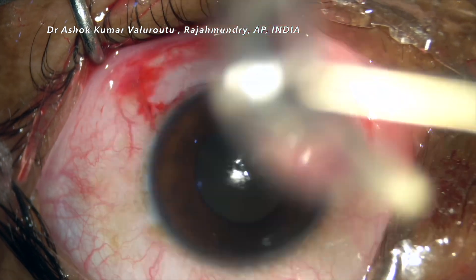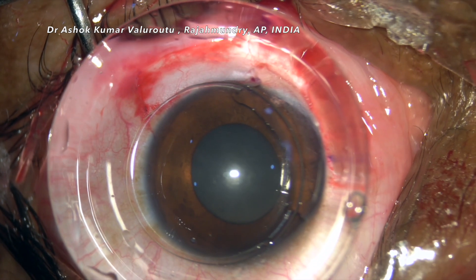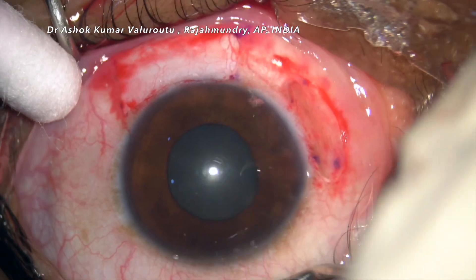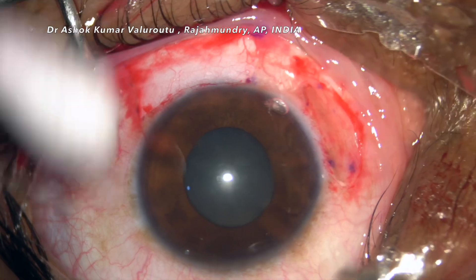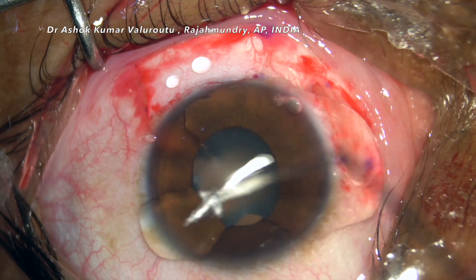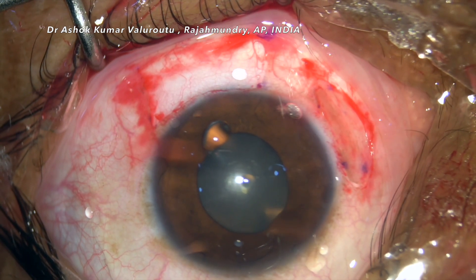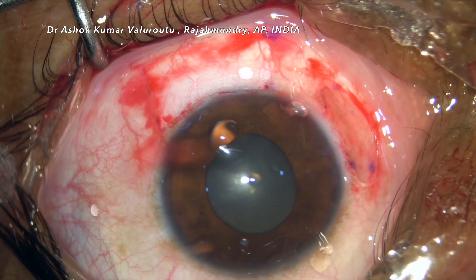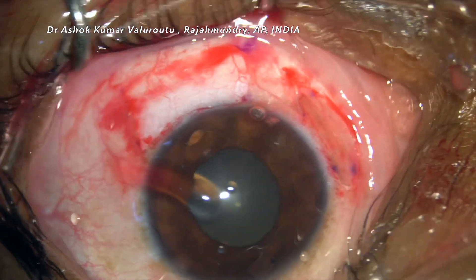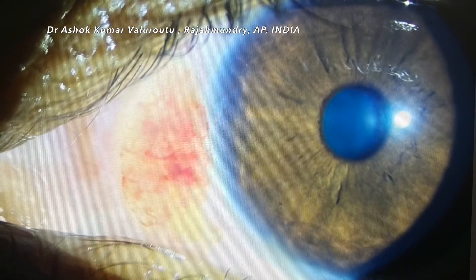The next step is placement of a sclerocorneal contact lens. The lens I am using is marketed under the brand name Terigo. Once it is placed on the cornea, we take the help of our assistant and evenly spread it so that the host area and graft area are all properly covered. We need to take care that it is not disturbed by the eyelid margin. Proper precaution must be taken while removing the eye speculum, as the contact lens can be dislodged. If small air bubbles are present after removal of the speculum, we ask the patient to blink once or twice.